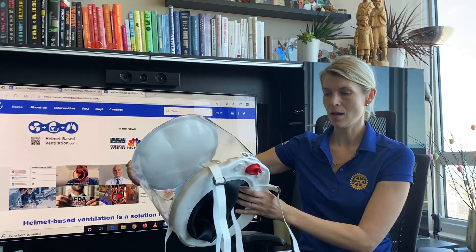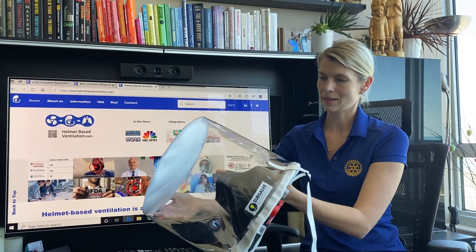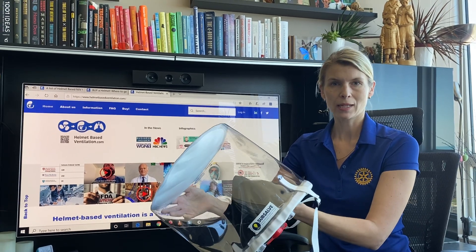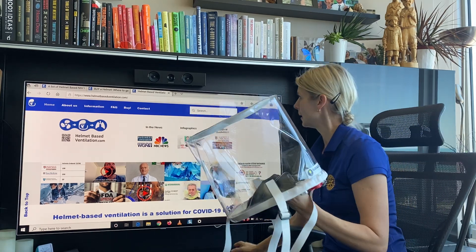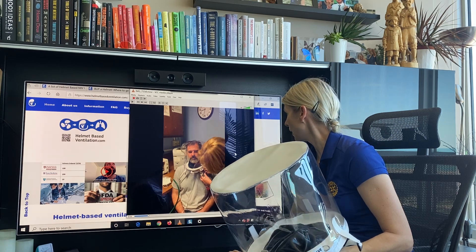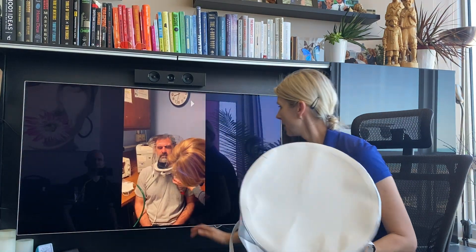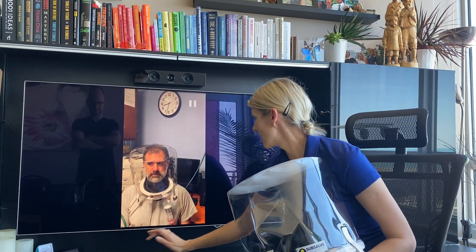In my hands I have a Subsalve helmet. Michael Lombardi sent it to us yesterday, so I am very happy to talk about it. Here is a video of the helmet inflated. You can see how it is connected to the airflow, with the PEEP valve and filter connected to it. It inflates instantly.